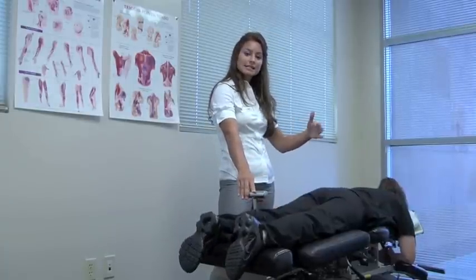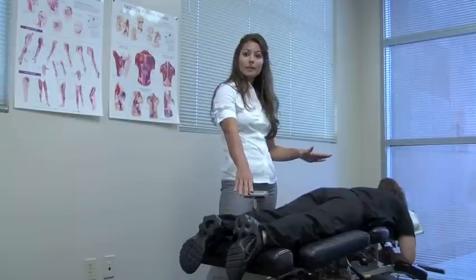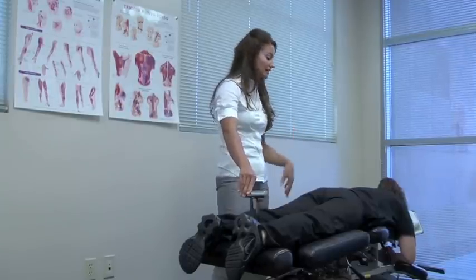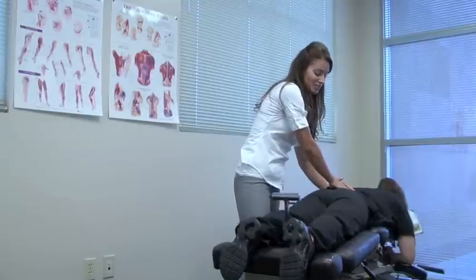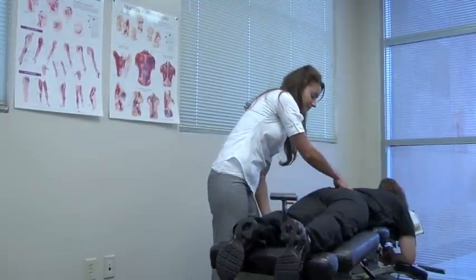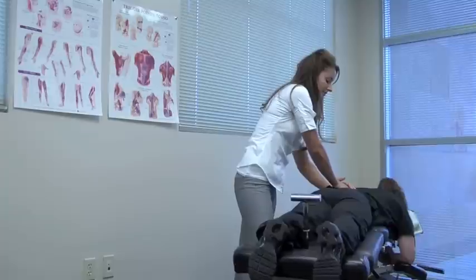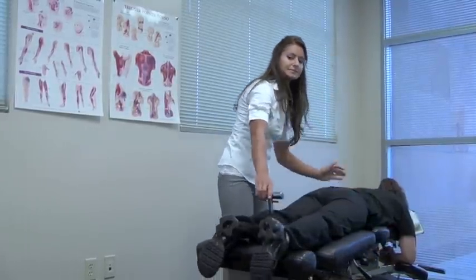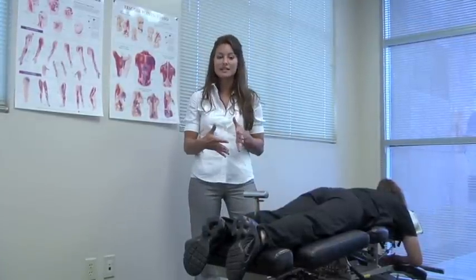There's also a side-to-side or lateral bend mechanism built into the table, which helps stretch the core muscles attaching to the spine, as well as alleviating pressure on the lower back. So I'm going to add some tension, and we'll do the side-to-side stretch. As you can see, this is a very safe, gentle, and controlled technique that helps the spine to heal.